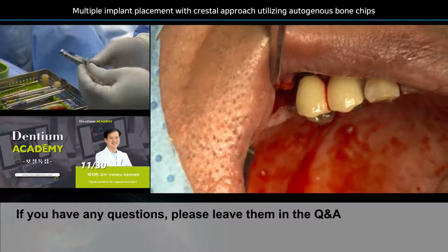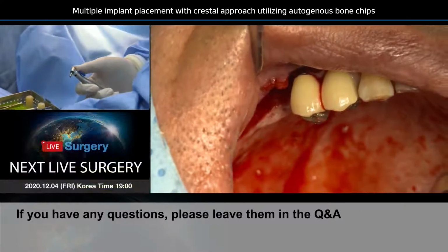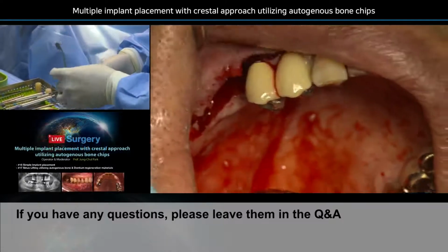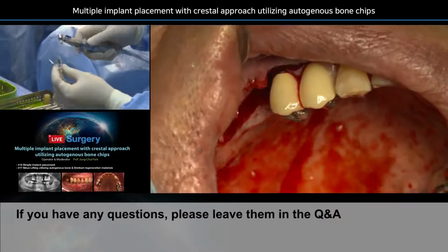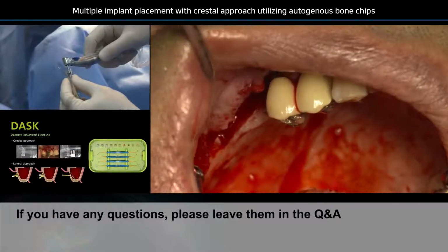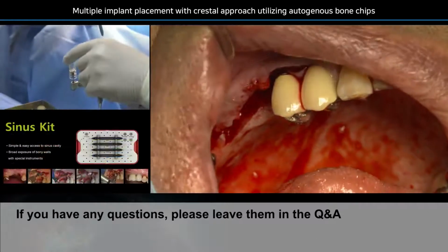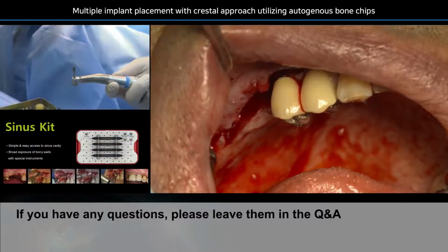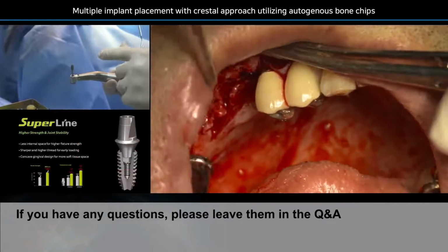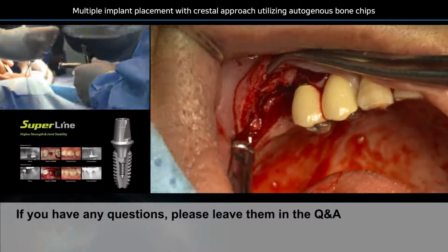Open up the vial. I'm changing to a shorter fixture mount here. Open up the vial, approach from the top, and rotate a little bit. And then tilt it upside down and remove the plastic vial. And then hit the pedal to see that the implant is rotating properly. And now we are ready for the placement.